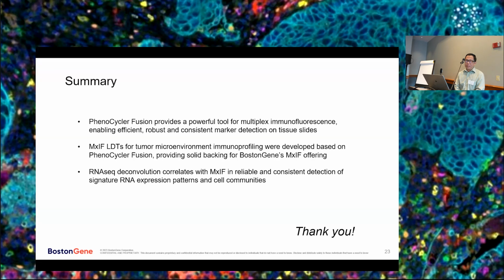Okay, as I mentioned earlier, we adopted this technology mainly because it can achieve a high plex. Other methods can achieve this high plex too, but this one causes minimum tissue damage. That's what we like.